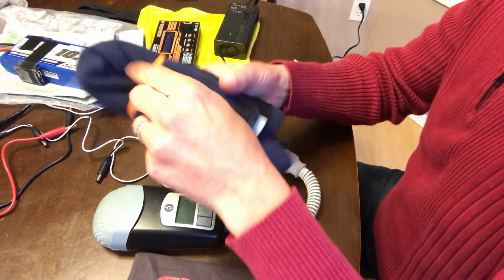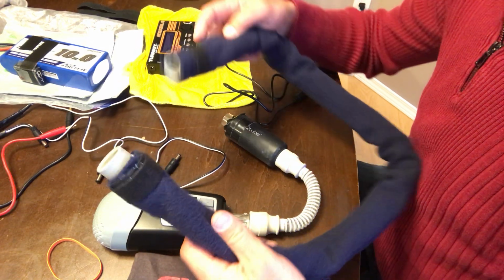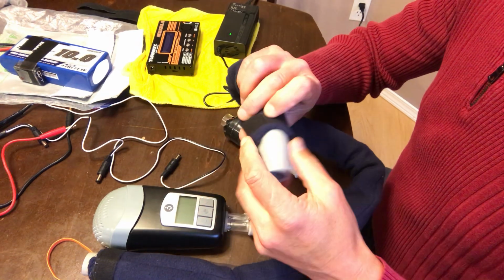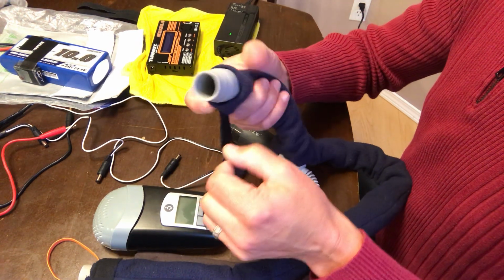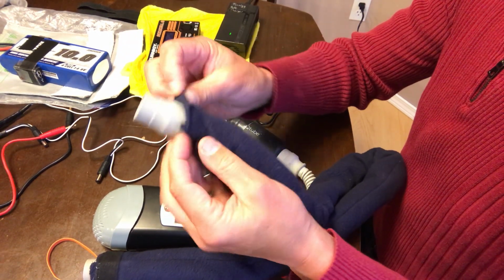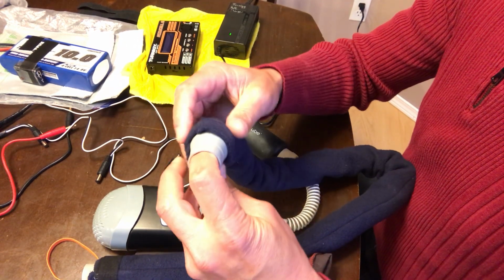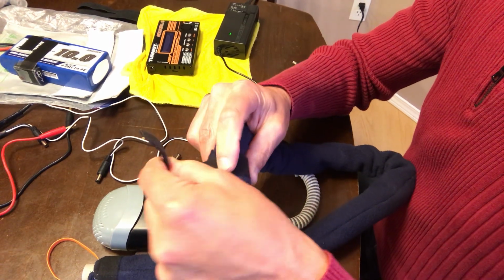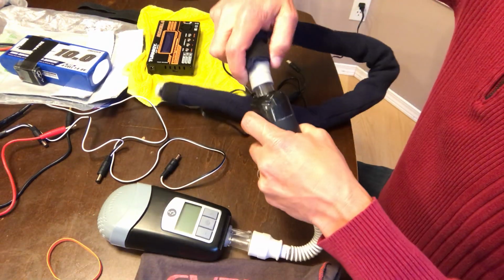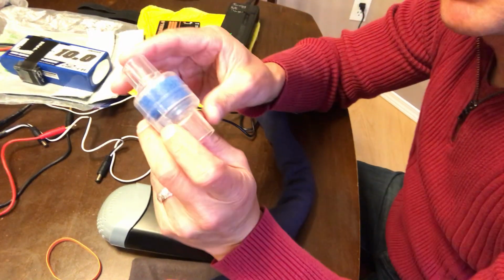Then you'll need a hose. So for backpacking, I went out and bought a 3-foot hose. So it's quite a bit smaller than your typical 6-foot hose. This one also has a cover. I sewed a little cover together. I found these online. They're really better. So basic tube, the fleece on here is more comfortable. It's quieter. It helps insulate from sound, and it's just more comfortable when you're wrapping yourself up, especially on a 3-foot hose. It's not a lot of length for you to get comfortable with, but it just goes on like a normal one would.